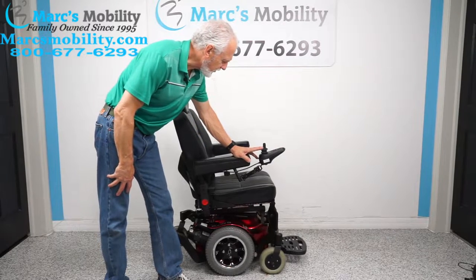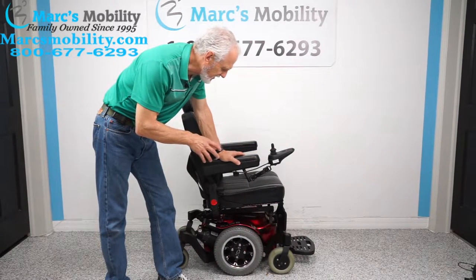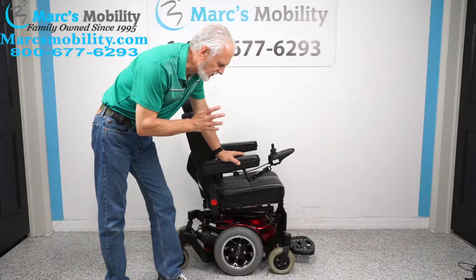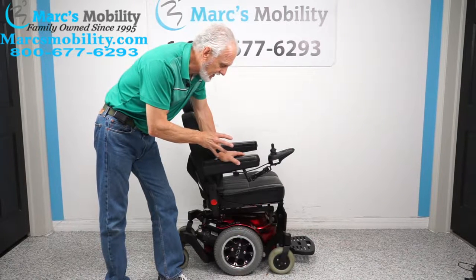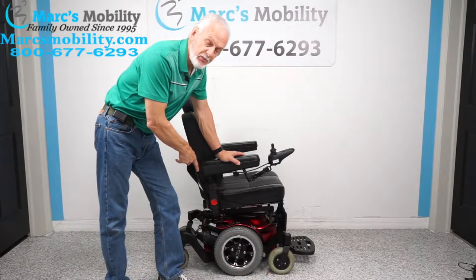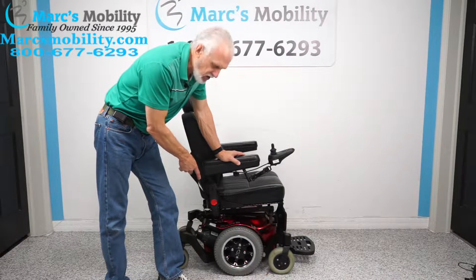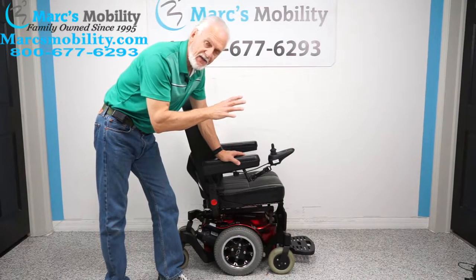We have a really nice chair here — the Quickie Pulse 6, made by Sunrise Medical. This is a fantastic chair for several reasons: it is quick, it is sharp looking, and it has four-pole motors. These are high-quality motors, so you get a lot of torque and a lot of speed. This chair is almost like a little race car.